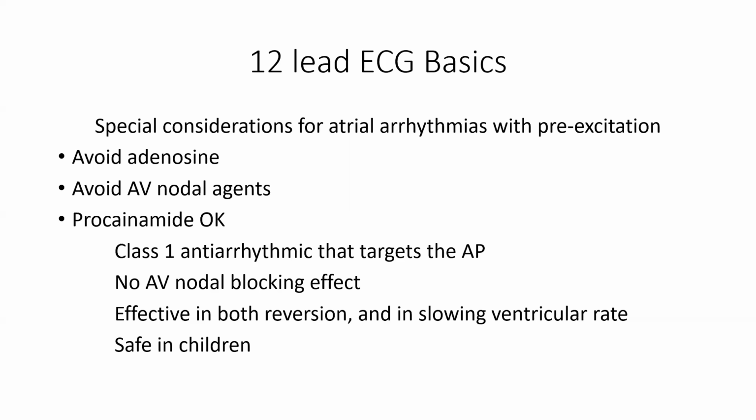That's something that might be more challenging in your line of work, in that if you are unable to see the delta wave on the EKG, or have concerns, what you're seeing is more of a wide complex tachycardia concerning for VT or VF.